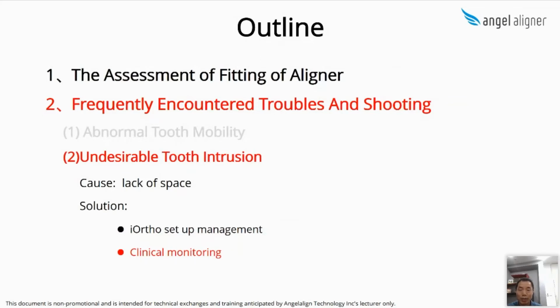I will use dental floss at every visit to examine the contact relation of every tooth, to make sure the teeth to be moved have a loose contact, so it's easy for them to move to the position that we designed. If the contacts are found to be tight, I will strip lightly with sandpaper to make sure the teeth have a minor space to move, even if no IPR was requested.